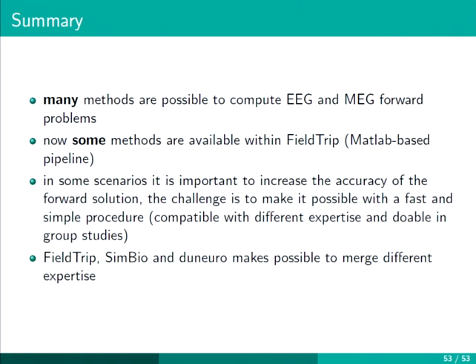Yeah, exactly. Like in this dataset here, it's quite accurate because the procedure was there was an ear mold, and they are basically the same in the MRI as when they were measuring the EEG. So here it's quite easy. Normal procedure, as you described, of course: if you want to find the preauricular points on an MRI, 1 millimeter here is already 2 millimeters here. So basically, if you have a little bit of offset here, it propagates through the whole head.